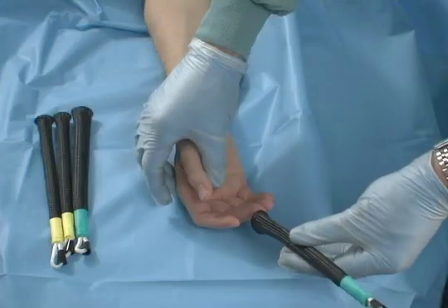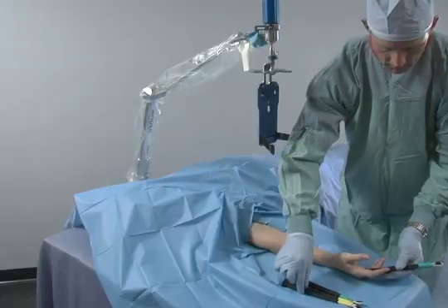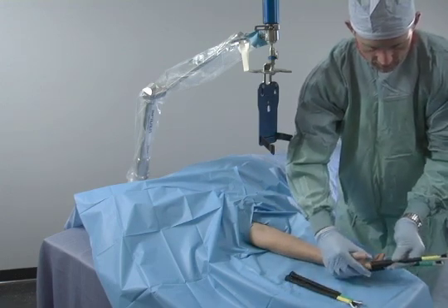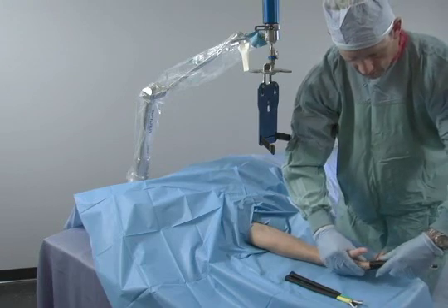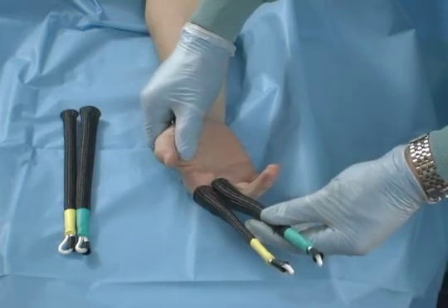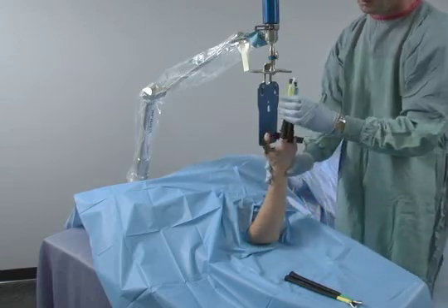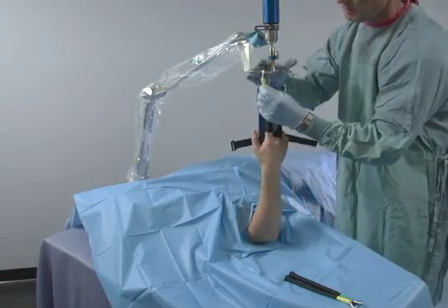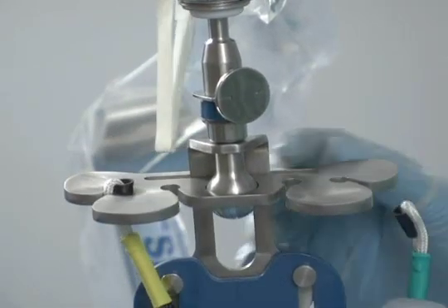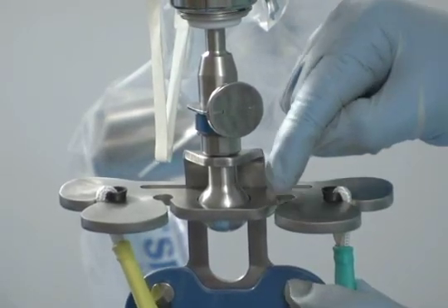The finger traps from the kit are placed over the patient's appropriate fingers — in this case, a large green and a medium yellow finger trap are used. Pull on the finger traps to ensure proper fit and no slippage. Ensure the black cones face the palm side of the hand. The hand is then raised and the finger traps are inserted into the cone shape receptors on the wrist arthroscopy accessory. The traps can be inserted into either the outside or inside receptors.